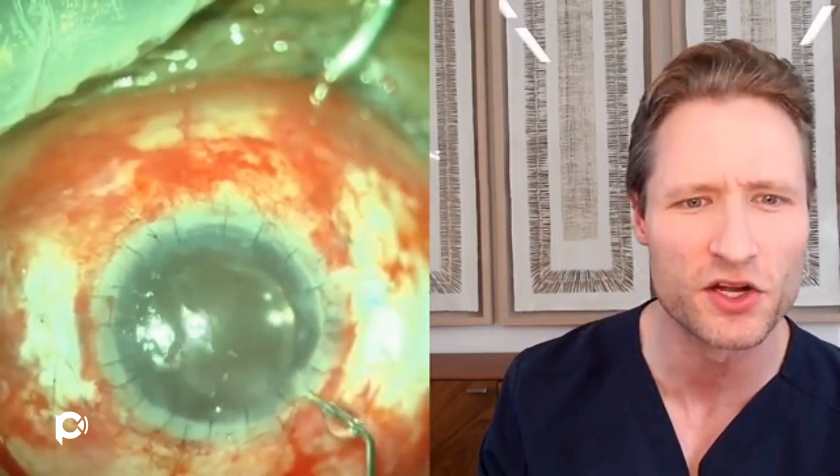I've got one haptic externalized and will do the same on the other side — here's our new lens, now centered in the eye. I'm closing the scleral flaps by suturing them with 10-0 nylon suture to prevent hypotony postoperatively, and then I will repair the conjunctival peritomies using tissue seal glue. Theoretically with a glued IOL you don't need to suture the scleral flaps, but in this case I'm doing so because this conjunctiva is so thin, friable, and has had so much trauma from previous operations.